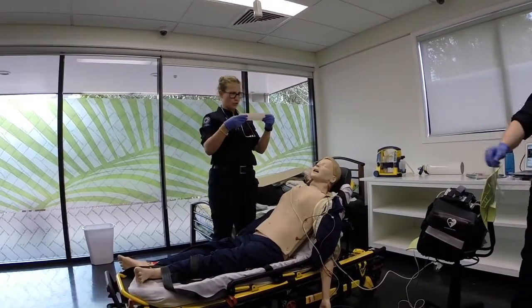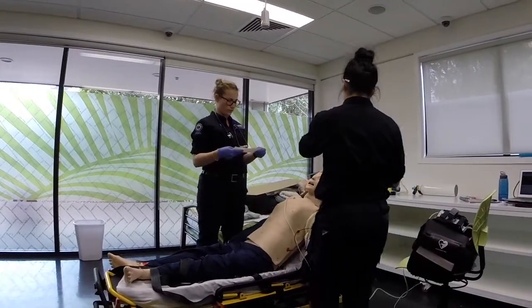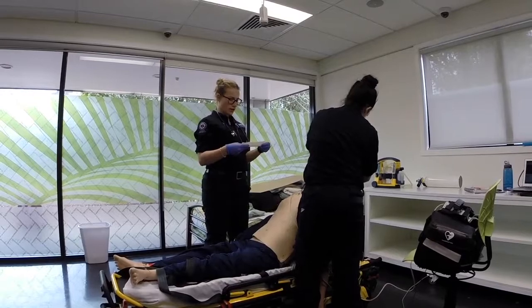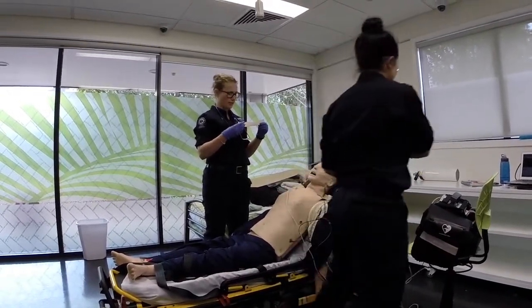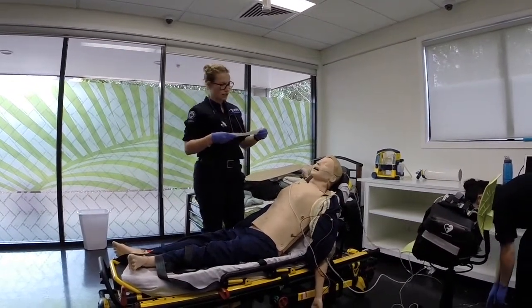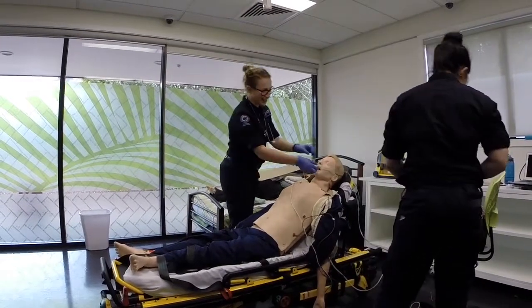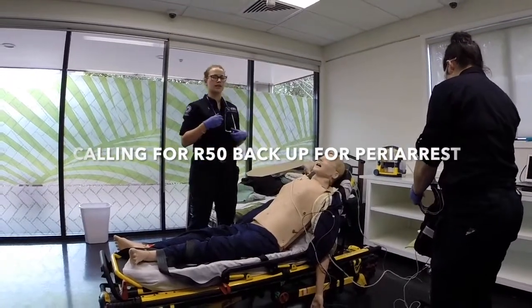Has this ever happened to you before, Bob? Oh, not like this. No, I hadn't. I think it's called an MI about 5 years ago. But I wasn't feeling as bad as this. It was totally different. It was different then? Yeah. Okay. So what I'm seeing is wide QRS complexes, no P waves, and it is regular. So I'm seeing VT. Is that what you see here as well? Looks like VT to me as well. Are you on any medications, Bob? That blood thinner, aspirin and Cilazapril.